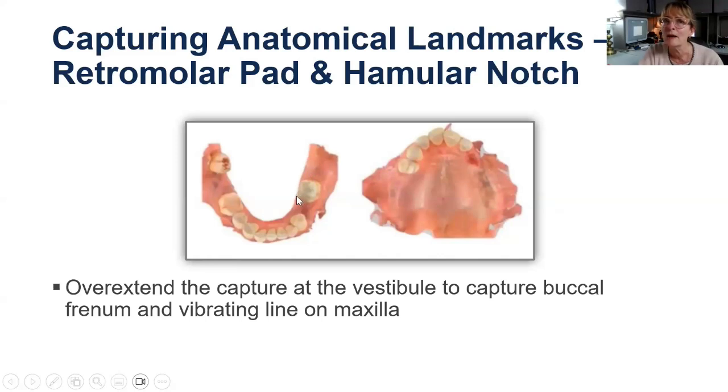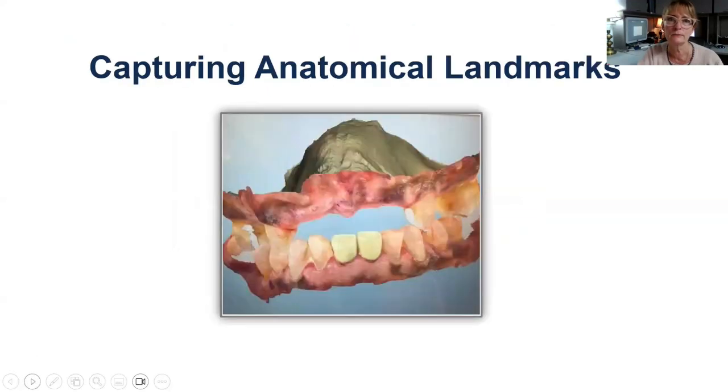And don't forget about the lingual data, right? That's really important, and it can be challenging to capture, challenging to acquire, if the floor of the mouth is sort of puffing up over the ridge, if the patient has less dentition than this. And that's just an example of a complete bite registration on that patient.